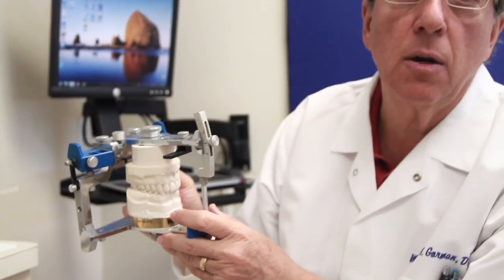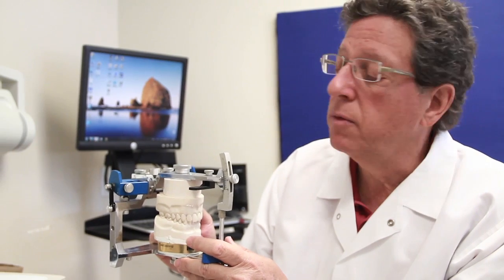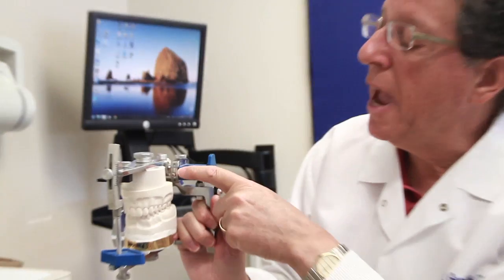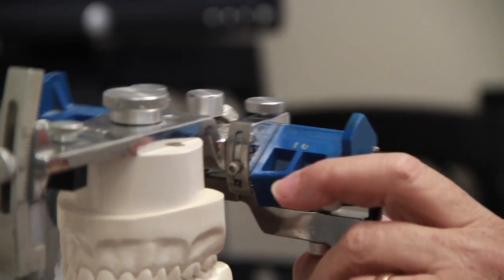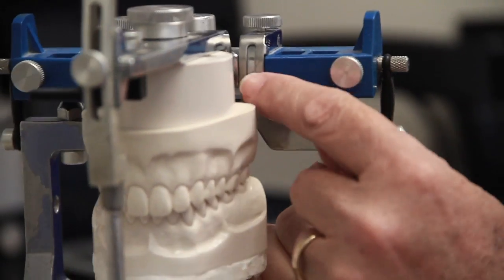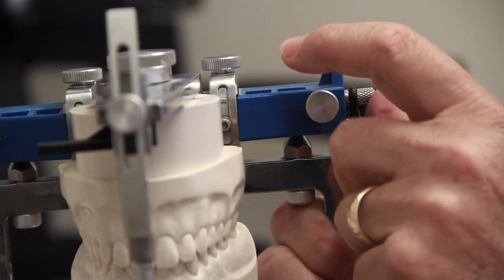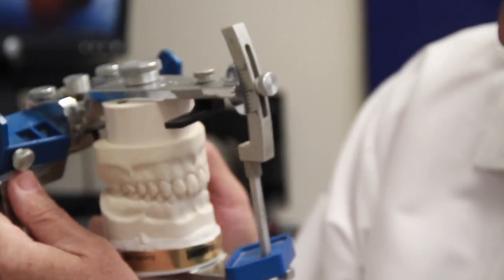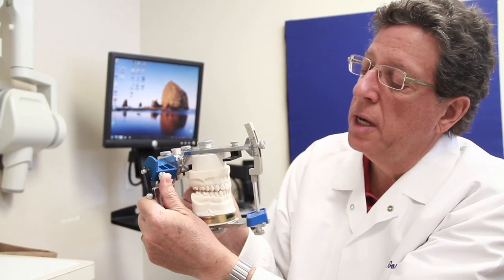Each side can be different depending on the data you accumulate. This is set at the average condylar inclination, but these analogs can be made really steep, or if I release this screw here, I can make them much more shallow. It's nice when people have a steeper angulation, because when that happens and you go into protrusive, it's a much more verticalized move.